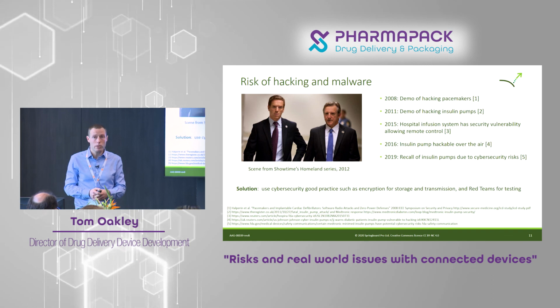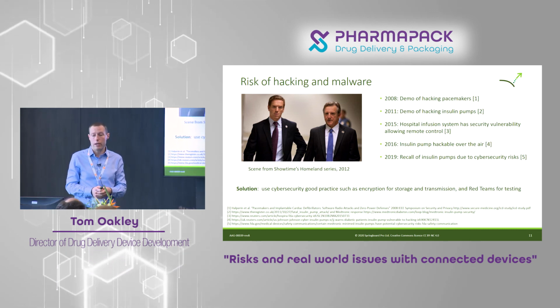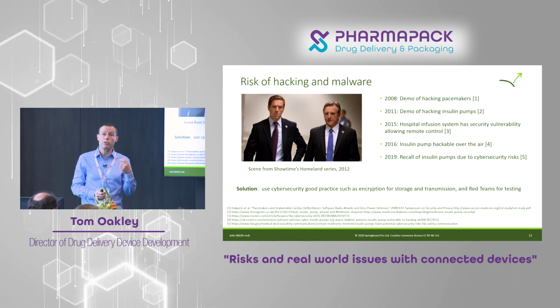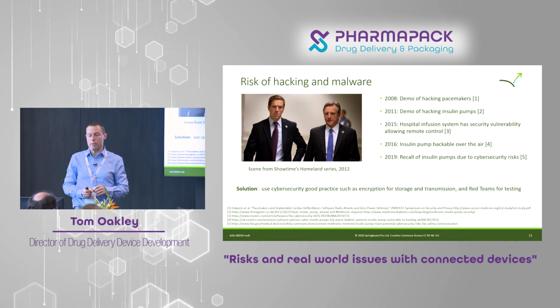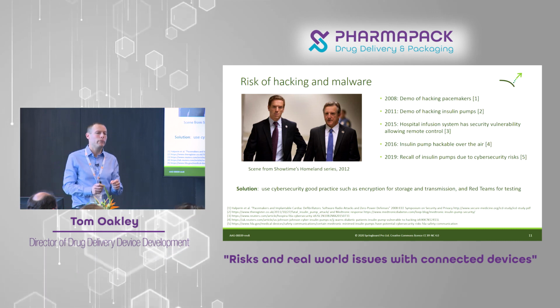The solutions to these are to use good practice, and there's lots of it, which we won't have time to go into today, but I could talk more about it another time, such as encryption. There's lots of different protocols and ways around that for both the storage and the transmission of data. And also to use red teams for testing. And red teams are not something that's often used in the pharmaceutical industry. So I'll explain briefly what they are.